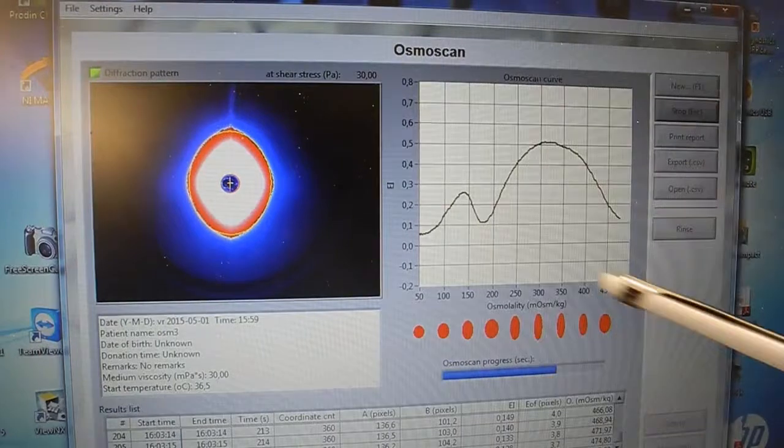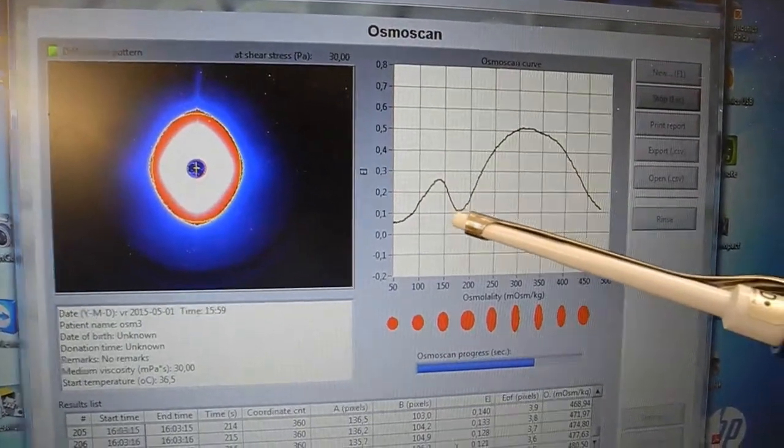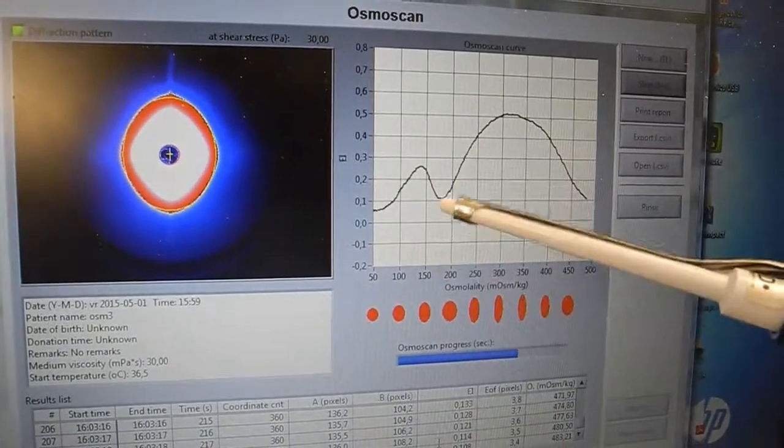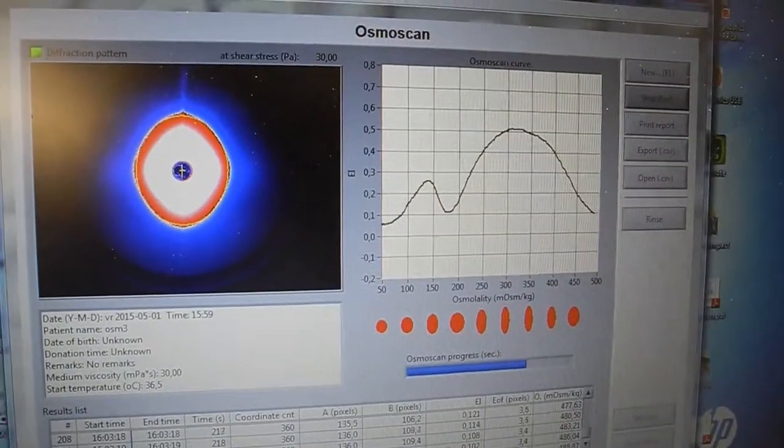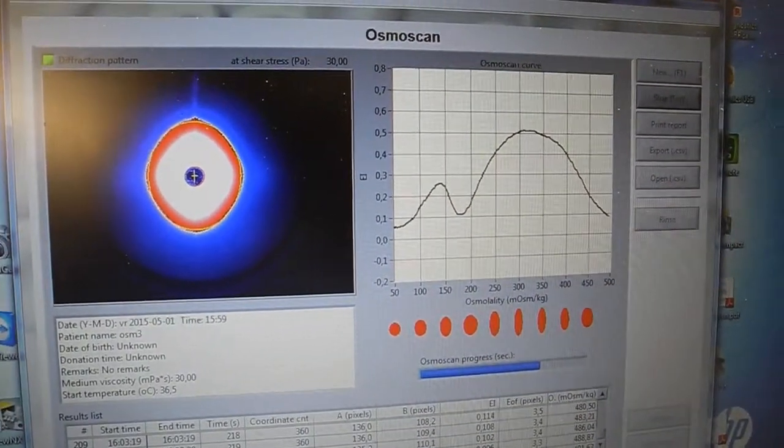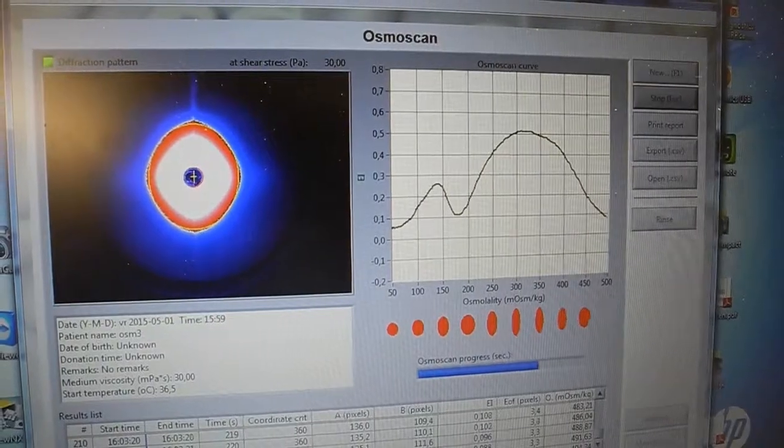And this could be considered the osmotic resistance of the cells of this person.